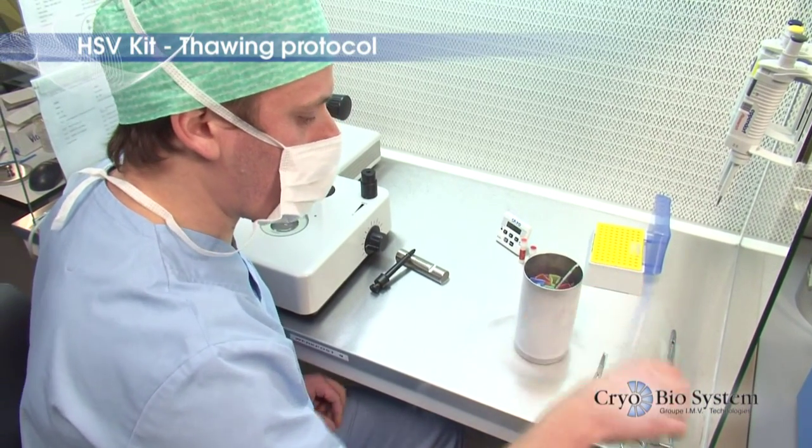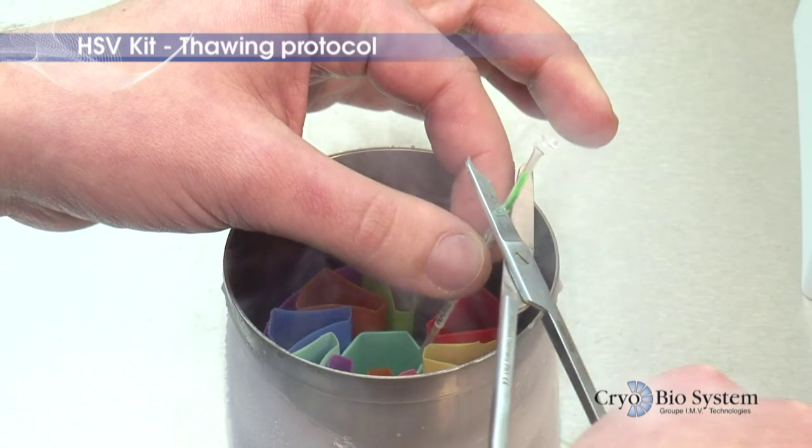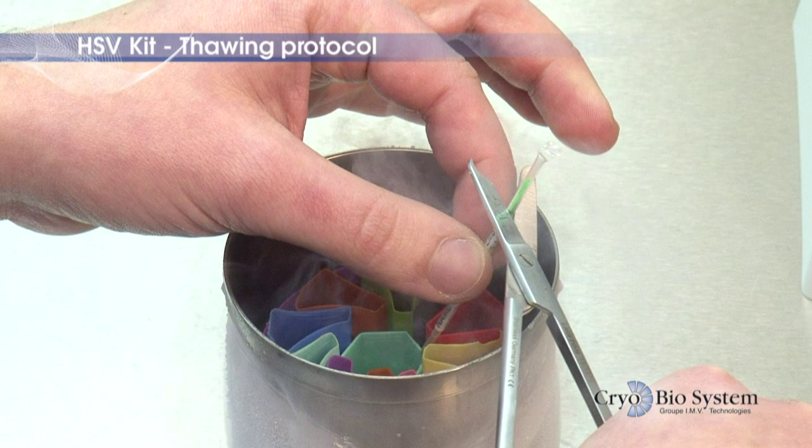Lift the straw enough to expose the coloured rod. Hold the coloured rod area of the straw with 2 fingers and position a small pair of scissors just above them, so the blades of the scissors are around the metal insert of the coloured rod.